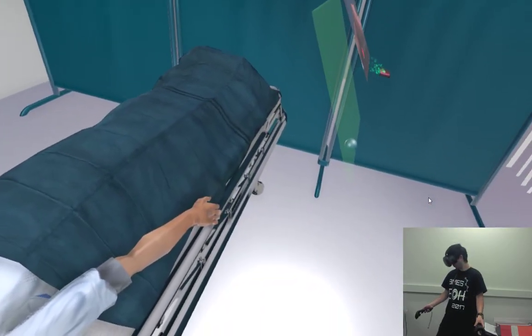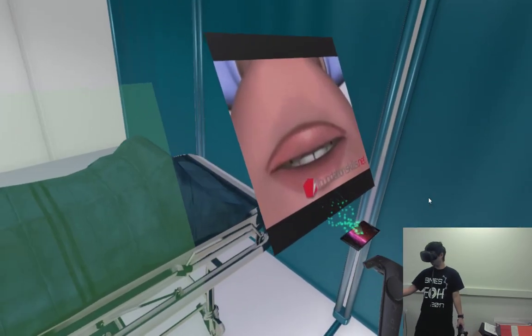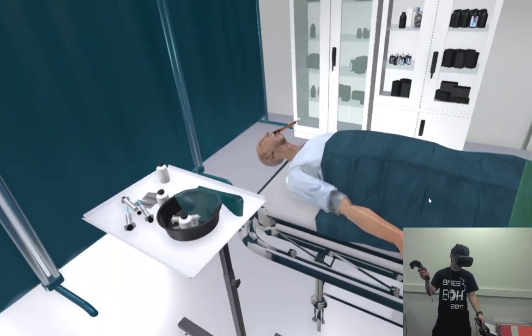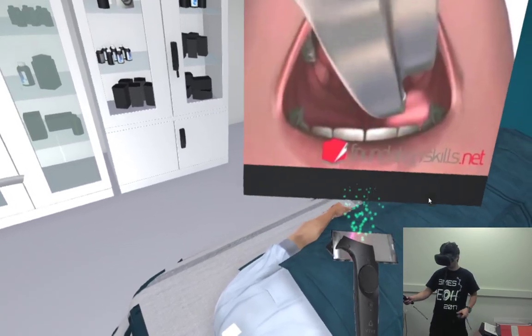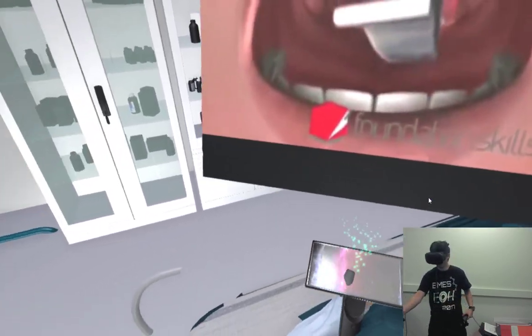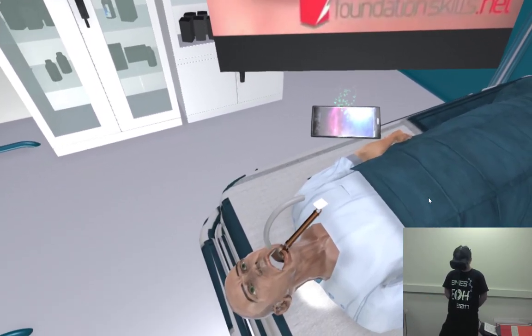Standing behind the patient with the head in the sniffing-the-morning-air position, with the left hand, insert the curved blade of the laryngoscope into the mouth over the right side of the tongue, displacing it to the left and upwards. Advance the laryngoscope slightly until the tip of the epiglottis can be seen posterior to the back of the tongue.